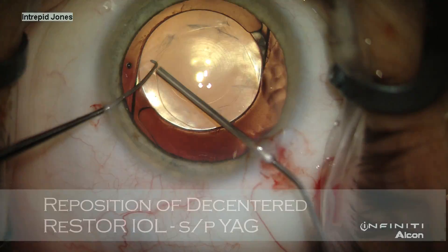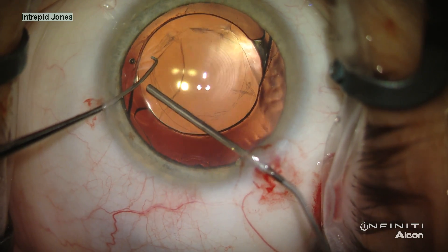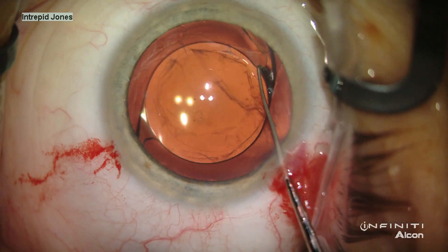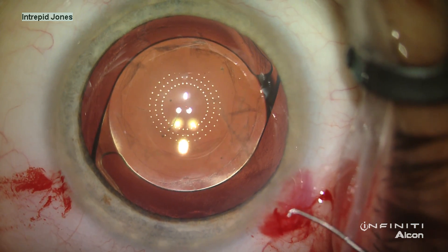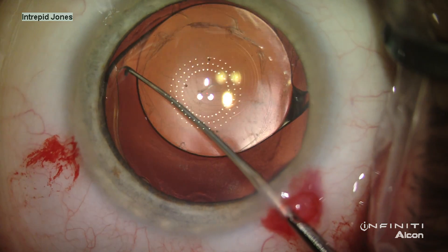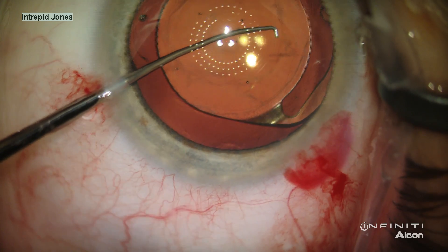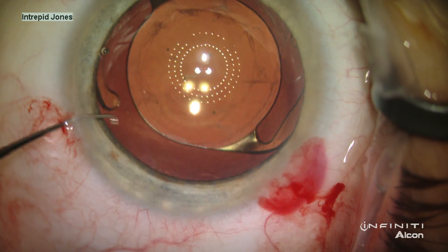In this last challenging case, an engineer has undergone Restore implantation as well as YAG capsulotomy several months post-operatively. Unfortunately, his lens is decentered and he has significant complaints of glare. With judicious and gentle viscodissection, the lens is freed from its current configuration and rotated. Then the placement of the lens is confirmed to be centered using the fixation beacon and the concentric pattern of the keratoscopic reflections as compared to the diffractive rings of the Restore implant.